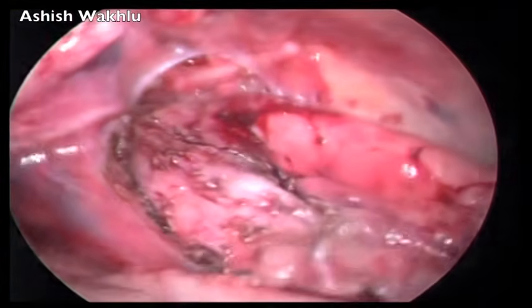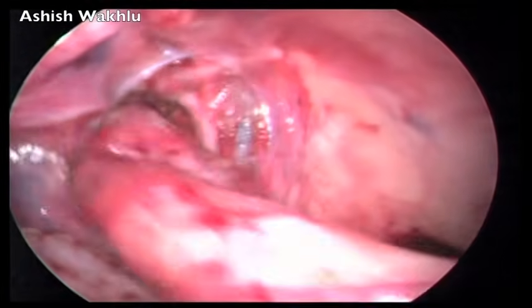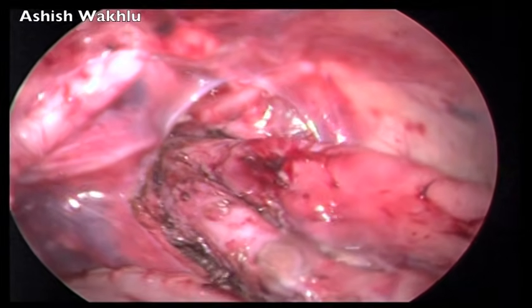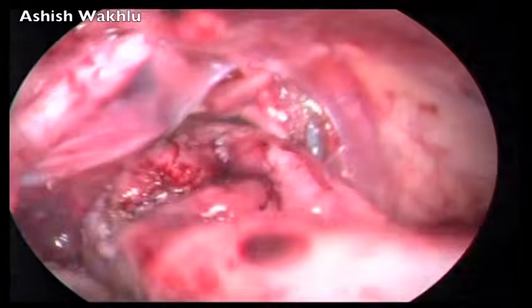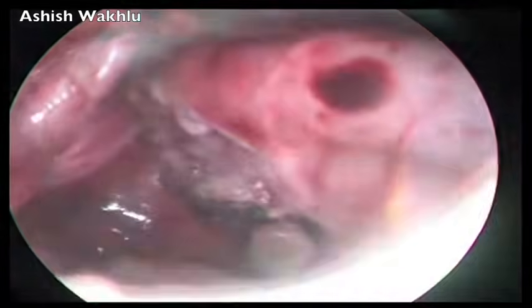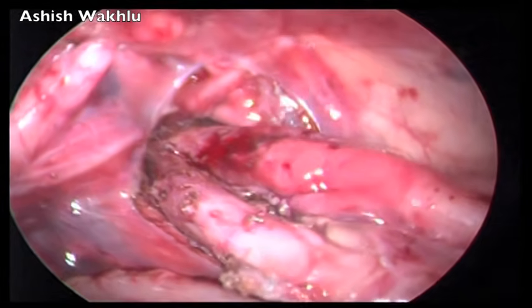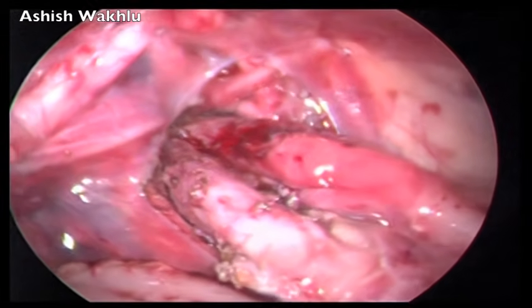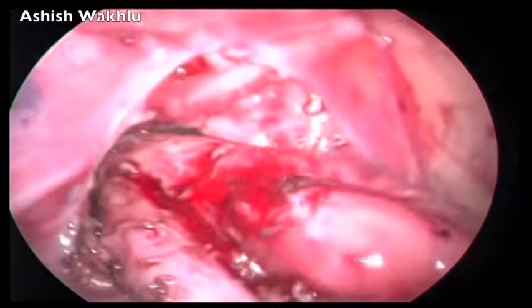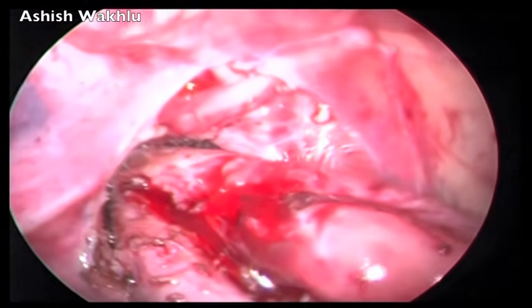One of the useful things to do before division of the fistula is to put a suction catheter into the distal limb of the colostomy and evacuate all the contents, the mucus, some accumulated stool, and most importantly, the mucosal blood that has oozed into the lumen because of the terminal rectum being grasped during dissection. This prevents any soiling of the operative field when the fistula is divided, and as you can see here, occasionally also opens up a coagulated blood vessel.